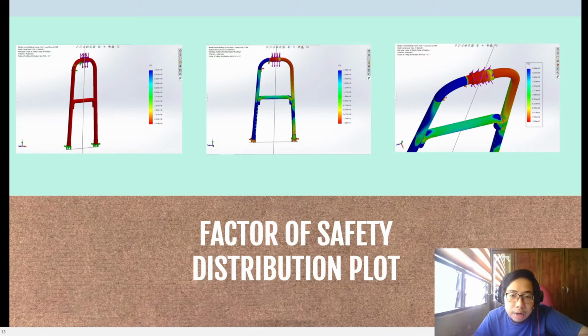Next, I will explain to you about the factor of safety distribution plot. As you can see in the first picture, all parts and components of the walking frame are in the red color. So, we make some adjustment and limit the maximum factor of safety distribution to around 2000 and get the second picture. As you can see, the critical part is in the red color, that is between the handle and the back side of the walking frame. If an unwanted thing happens when the person stands up, the most likely place to fail first is the red color.